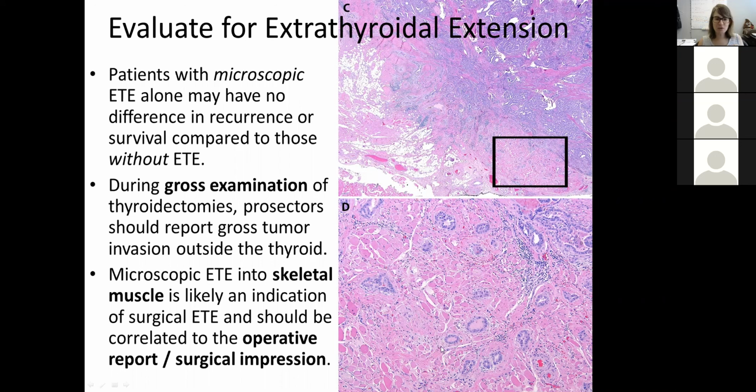Right, when I see infiltration of PTC into skeletal muscle microscopically, I ask you, did you see it grossly? And I ask the surgeon, did you see it intraoperatively? Because if they said, oh yeah, it was really stuck to muscle, I had a hard time getting it off, to me that's gross ETE, to me that upstages the patient, right? So this is a clinical pathologic correlation now that we have to do for ETE.